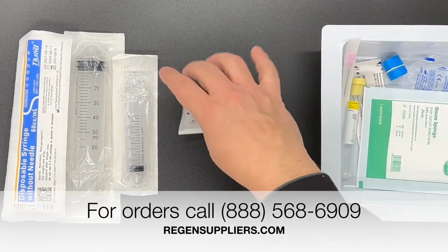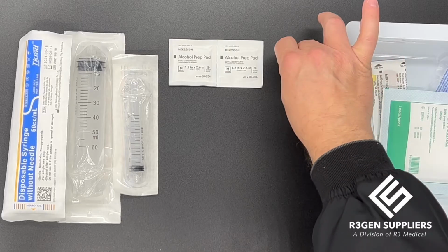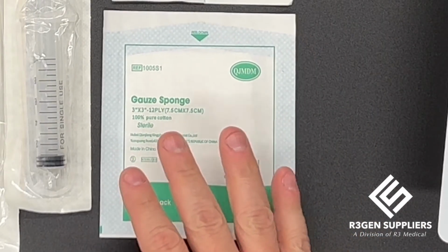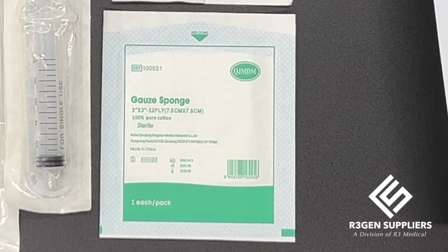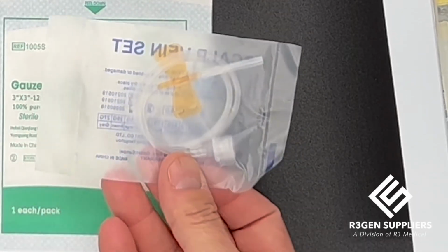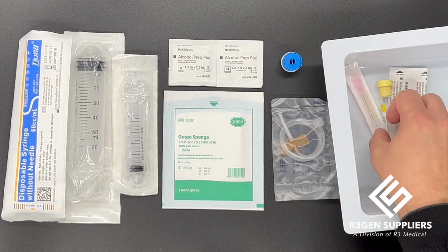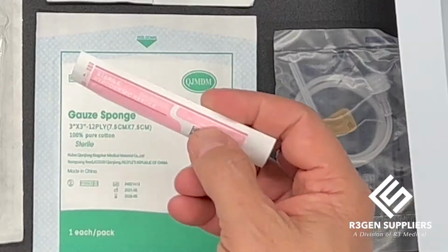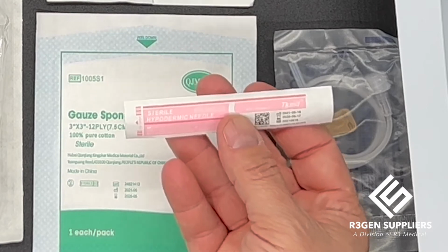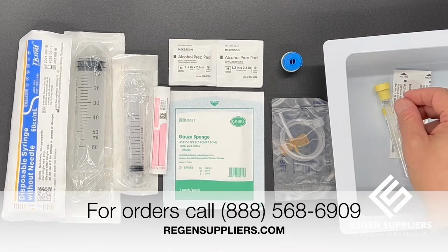Okay. Now, let's go a little further. You'll notice that there are two alcohol prep pads as well as a tourniquet. There's also a gauze pad, a gauze sponge. There is a butterfly needle, which you can see easier if I flip it that way. Then you also have an 18 gauge needle if you need to drop the blood and then switch it from the butterfly to this to then put it into a PRP or PRF kit.